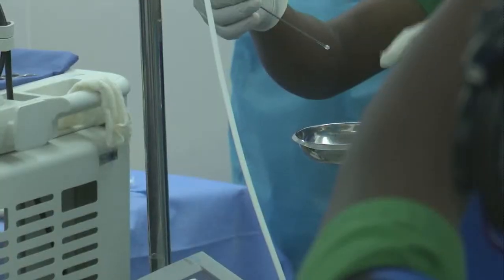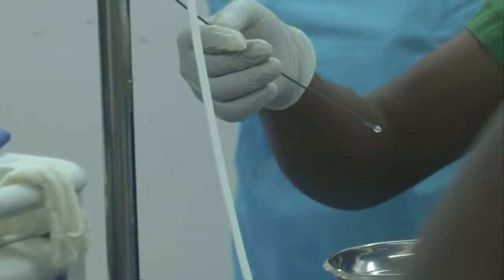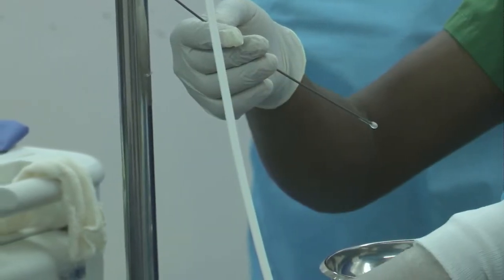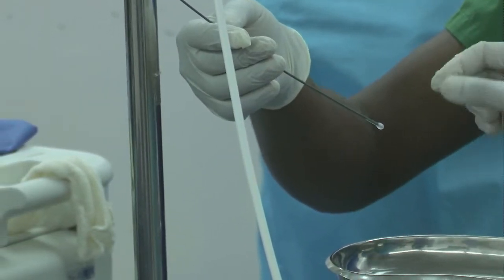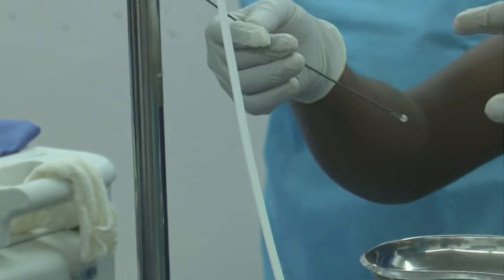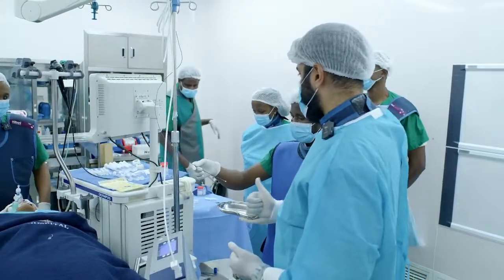So that tells us, one, the probe is working and we have enough gas in here. And the second is, it's going to tell us roughly, if we froze for 5 seconds, what sample size we are going to get. And this is a fairly good chunk. So we do this before every procedure. We make sure everything's working like that.